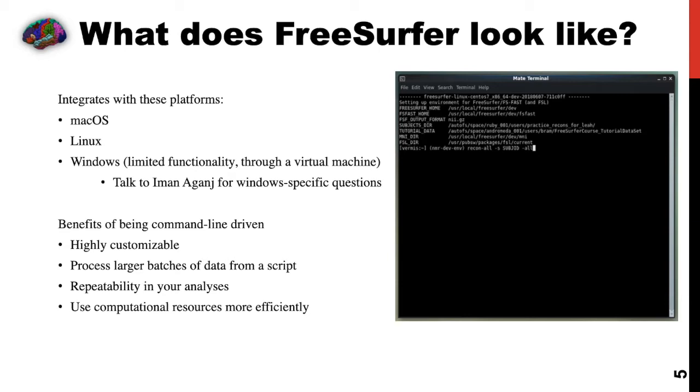So we provide a lot of resources to give you a little more comfort with the terminal and with using Linux. That's available on Mac, obviously Linux computers, and Windows. It's available to you at the Martinos Center, and actually on any computer.